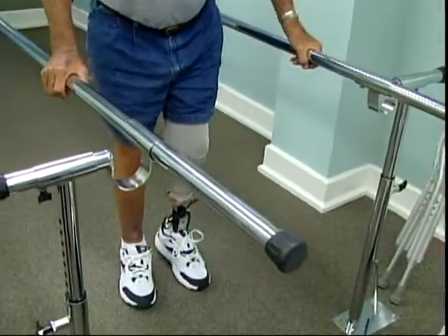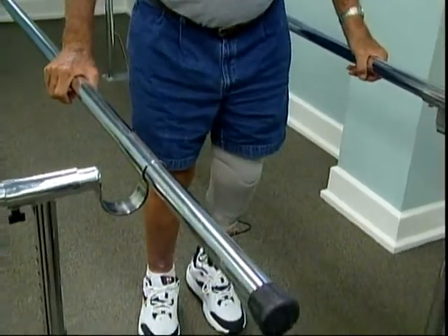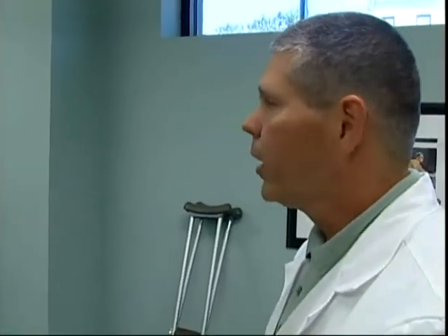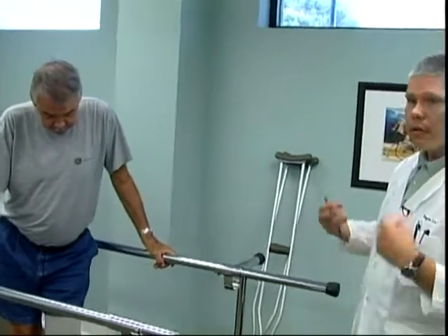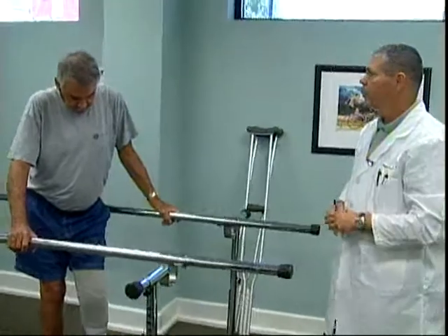Is that measured in foot-pounds of vacuum power, or how is that? I'm just curious. Inches of mercury. There's 18 inches of mercury inside the socket right now. That can be adjusted as well, up and down. If he's going to be sitting in a car for a long period of time, he doesn't need that much vacuum, so we can manually go to the device and lower that amount so there's not as much squeeze or pressure on the limb over a long period. On the other end of the scale, if you know you're going to get out in the farmyard and chase after the cows, you can crank it up all the way and know it's going to be really secure when you're walking in potholes and ditches and gravel and whatnot.